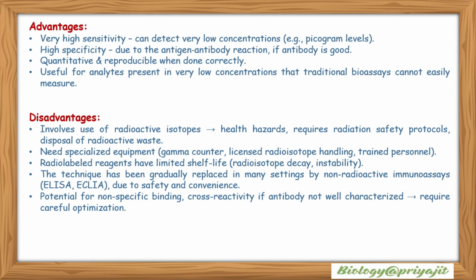Advantages: very high sensitivity, can detect very low concentrations, picogram levels. High specificity due to the antigen antibody reaction if the antibody is good. Quantitative and reproducible when done correctly. Useful for analytes present in very low concentration that traditional bioassays cannot easily measure.